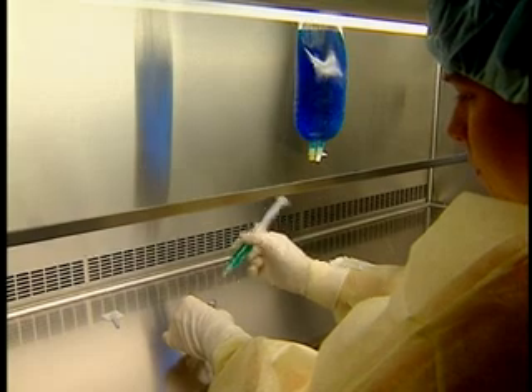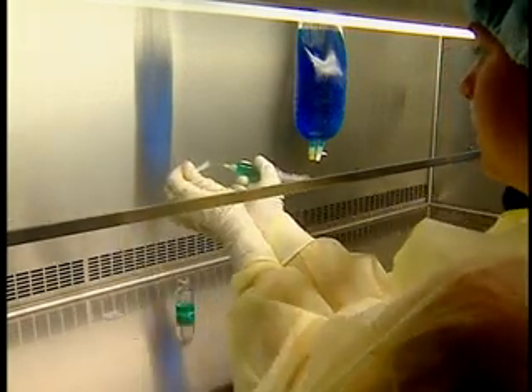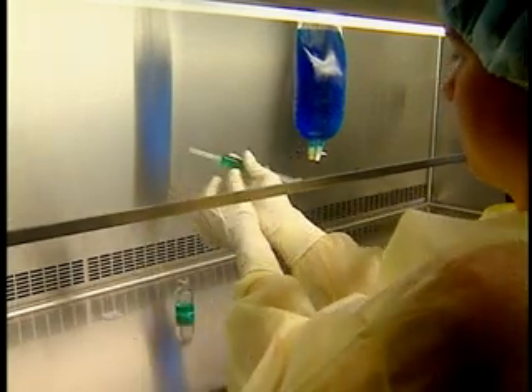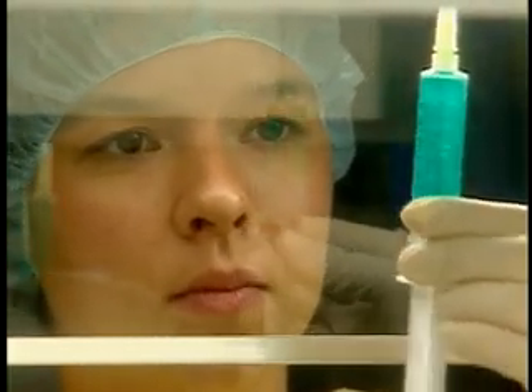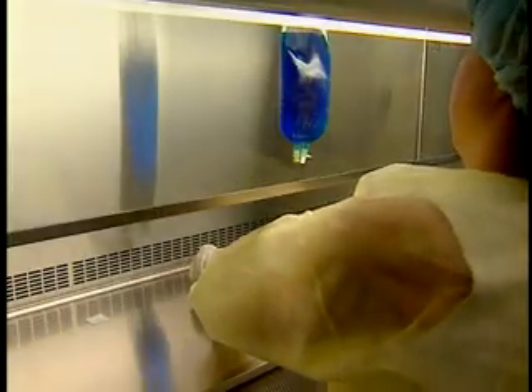Place the vial on the work surface. Remove and recap the needle. Check the volume and quality of the finished product. Place the syringe beside the vial for further verifications.